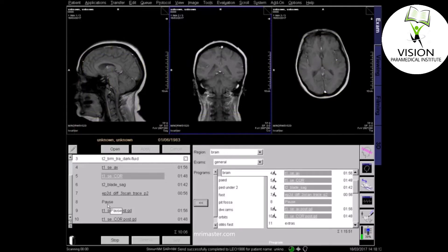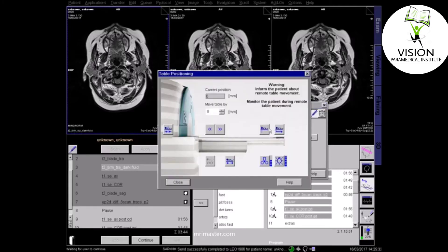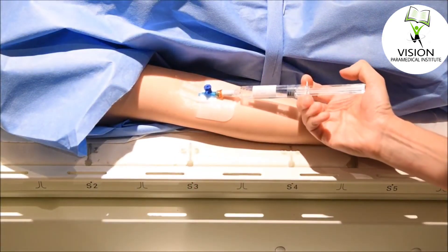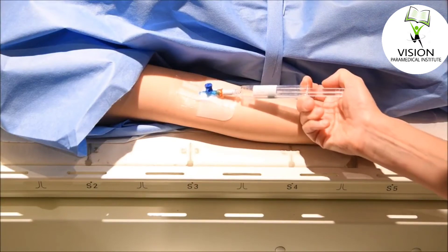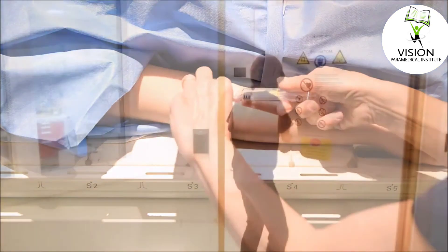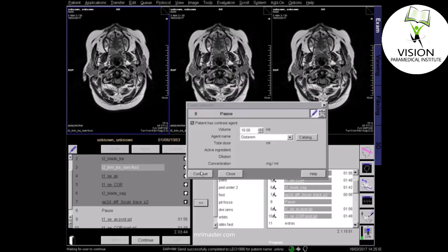Once the precontrast sequences are complete, make sure the correct contrast name and volume are entered into the scan details, following radiologist or hospital protocols. Remind the patient to lie still as they may need to be moved out of the scanner to administer the contrast. Inject the contrast following the hospital and manufacturer's guidelines. Check that the contrast has not tissued or extravasated and that the patient is feeling well before you leave the room.